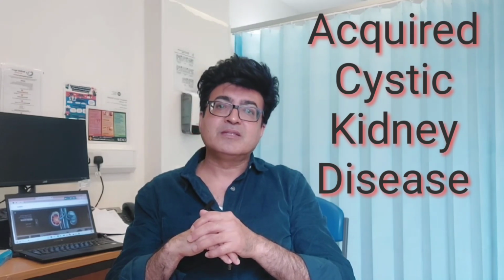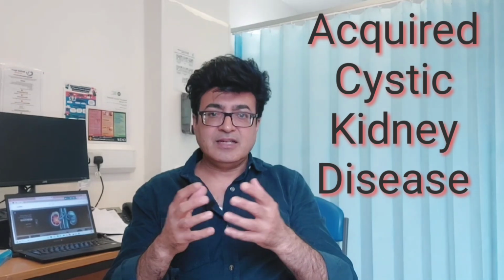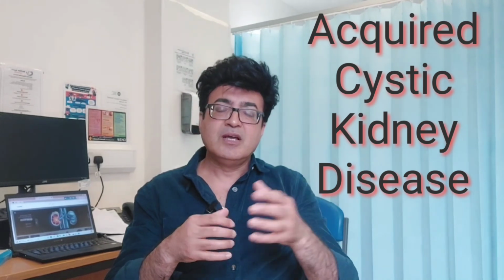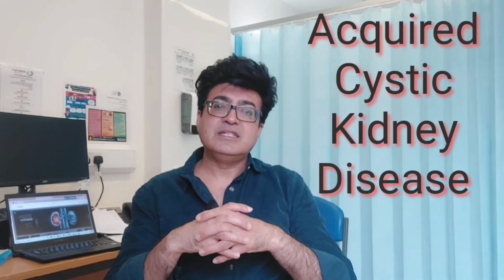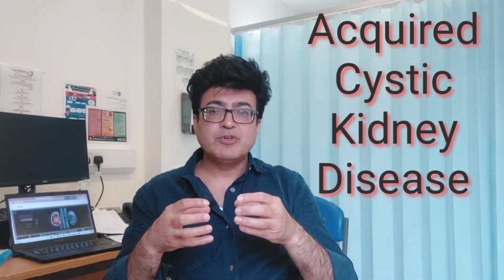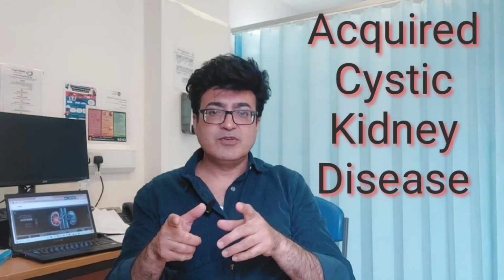With respect to the renal system, today my topic is acquired renal cystic disease. As the name shows, it is not congenital, like polycystic kidney disease, adult polycystic kidney disease, which happens to be congenital. This is actually acquired, and in acquired renal cystic disease the kidneys happen to be either small in size or maybe normal in size. This is the criterion which makes it distinguishable from adult polycystic kidney disease.